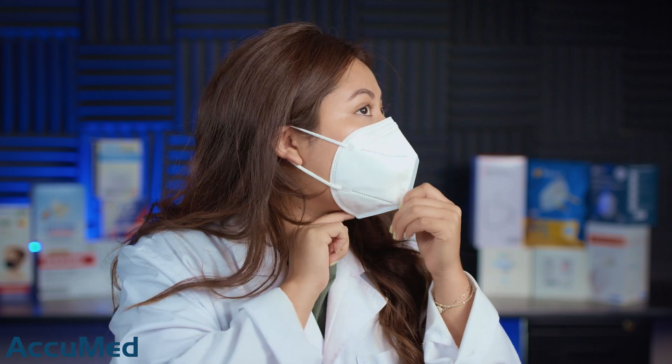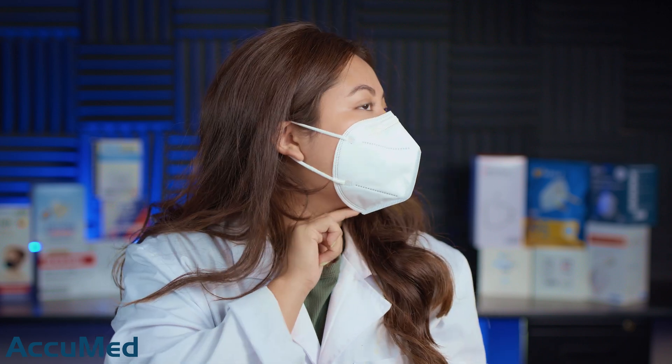I'm noticing quite a bit of collapse whenever I inhale, and I'm not getting a perfect fit on my face. This is probably a medium size mask because I am still getting some leakage on the bottom of the mask — not as much as other masks that usually run large on me. Doing a quick seal check, I am getting quite a bit of leakage throughout the face and not a great fit. These are more leaning towards a medium size.